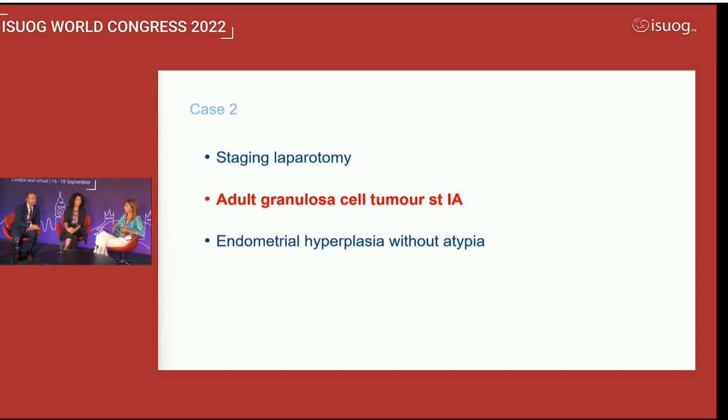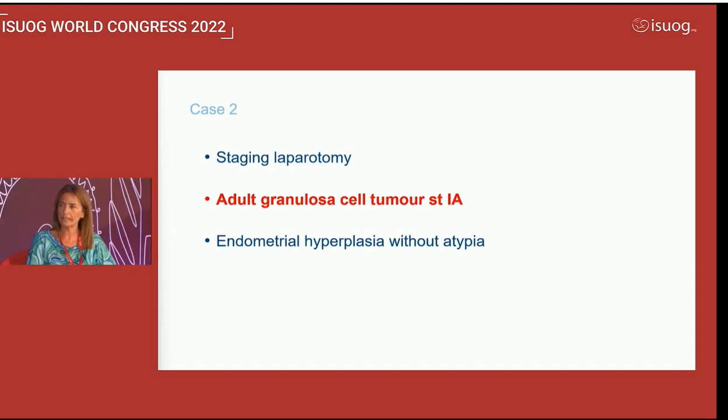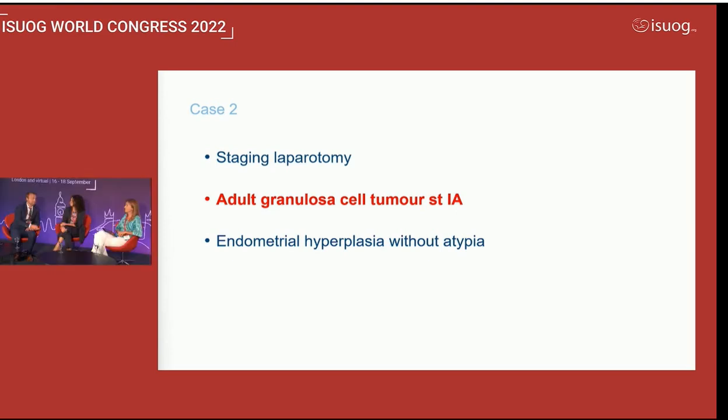Before moving to the second part, I want to ask you, do you think that there is a space for radiomics to differentiate an ovarian fibroma from other malignant solid lesions, in this so difficult category of solid tumors? Well, there's a lot of solid tissue to look at, and maybe the aspect of the solid material can be interesting to look at some subtle differences. It should be interesting. We will see in the future.